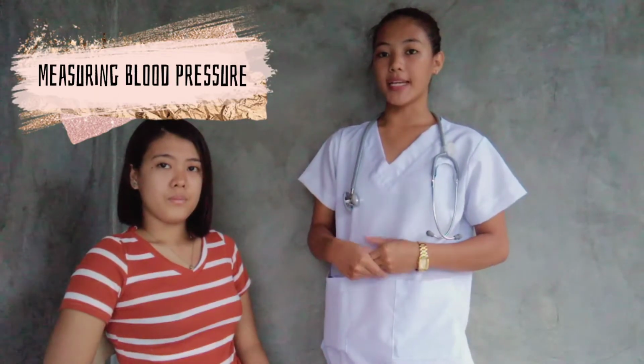Her respiration is 16 breaths per minute. It means that it is normal because normal respiration ranges between 12 to 20 breaths per minute. Now, I will be taking the blood pressure of my patient, and to perform that, we will need the equipment. We will be using a stethoscope and a sphygmomanometer. So let's start.